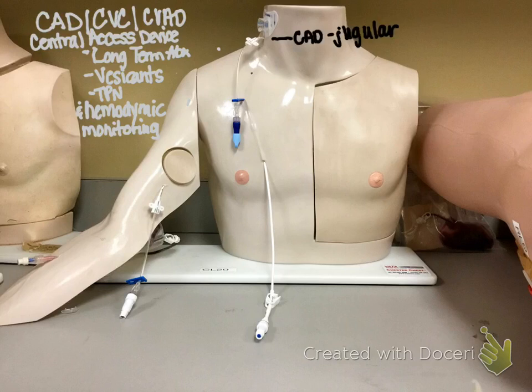So the first one I just want to show you here is Chester Chest, and he is one of our models. He's just got all the lines here. The only one that he doesn't have, because we don't have his lower half, is a femoral. Now, you will often see a central line put in the femoral. Usually with the femoral, there's definitely an increased risk of infection, because you have to think about where that is. But sometimes they will use the femoral if the other places are not available, or if they're in a hurry, or it just depends. So you may see a central line access device put in the femoral as well.